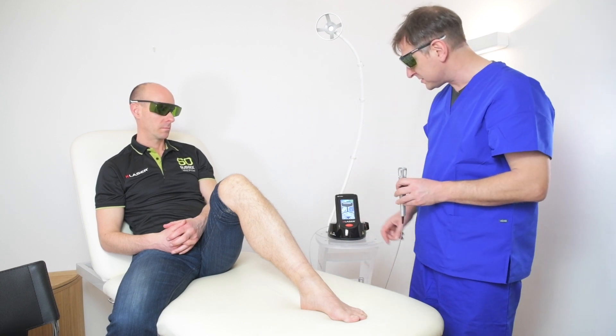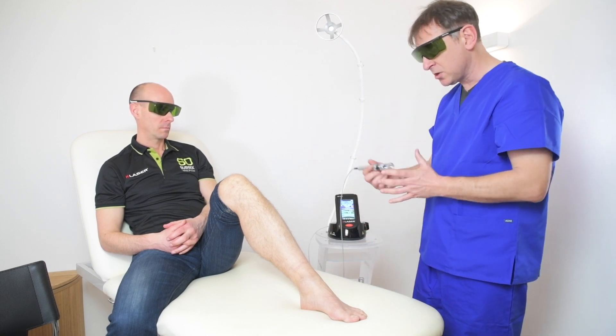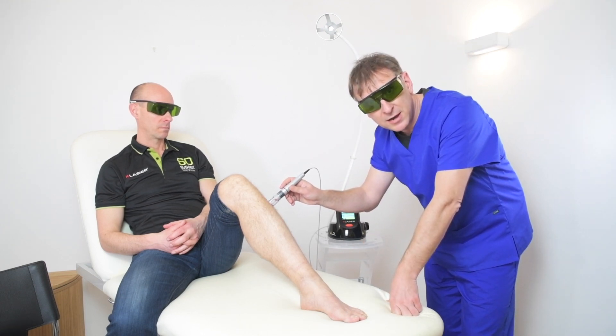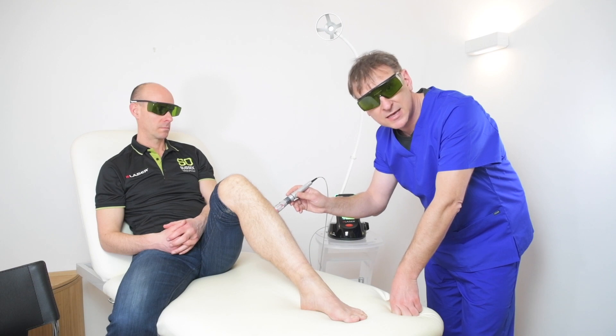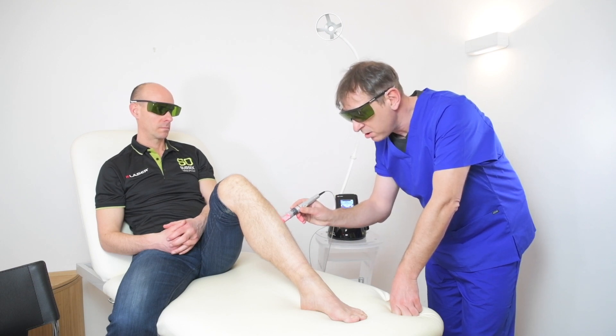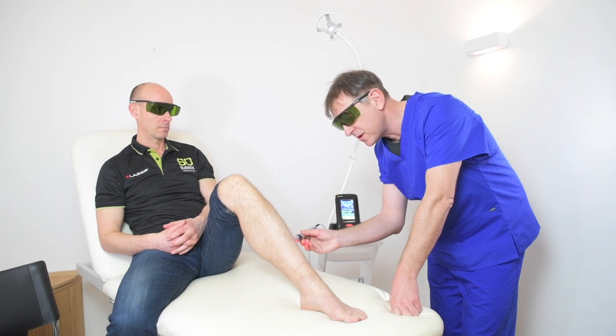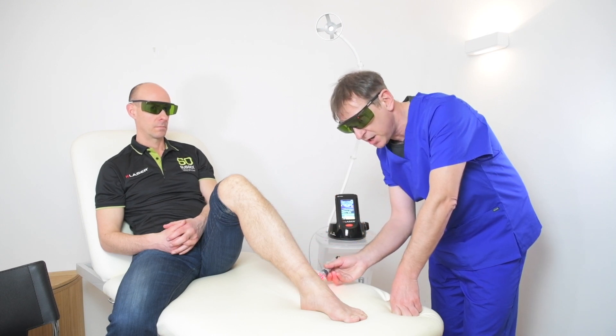When we treat someone with a diabetic foot ulcer, we usually use the standard head. We initially start on the upper leg beneath the knee itself and we work on areas where we are able to concentrate the beam to improve perfusion to the lower leg.